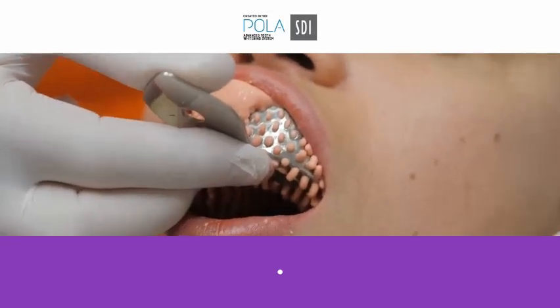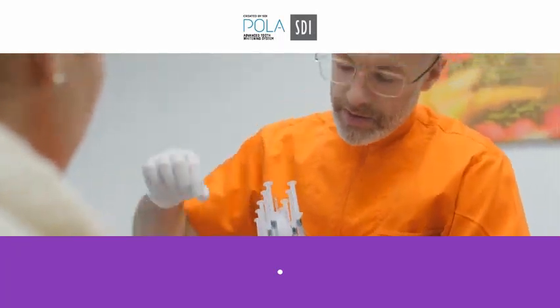So if you've got any crowns in your mouth, or any big fillings in your front teeth, they will not whiten. So we will have to replace those afterwards. So you've got to understand what the actual whitening process is. So in your box, this is really key, really, really important.